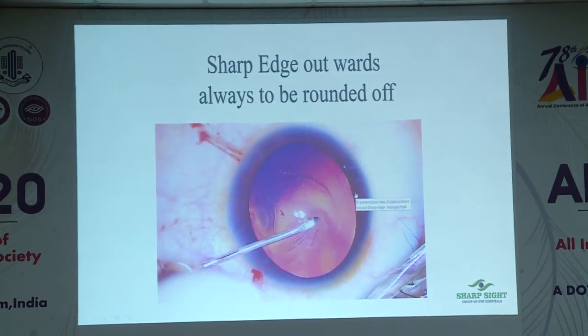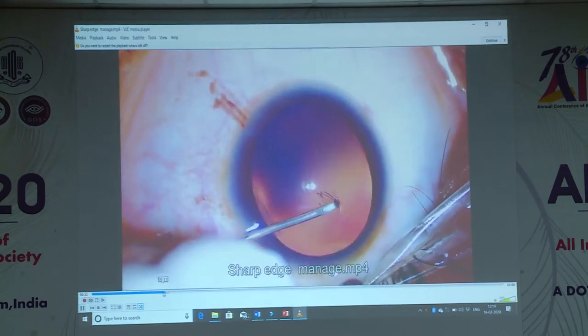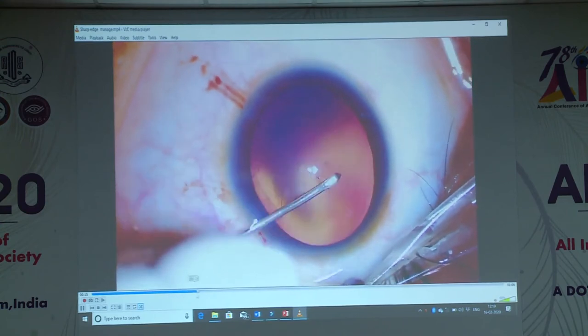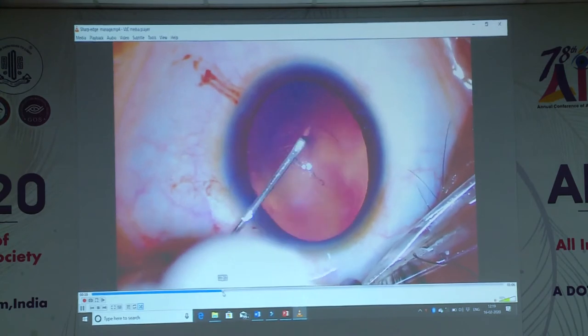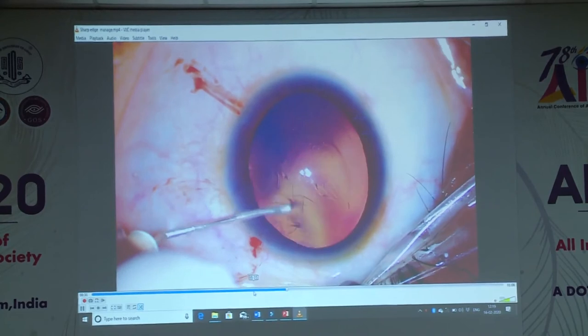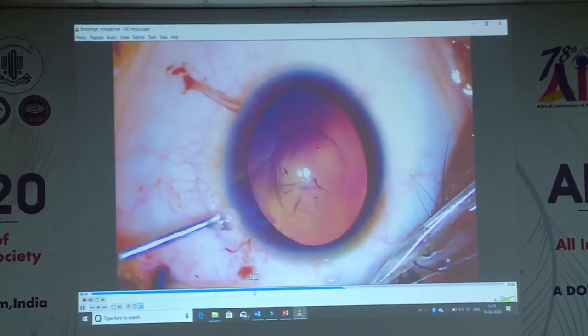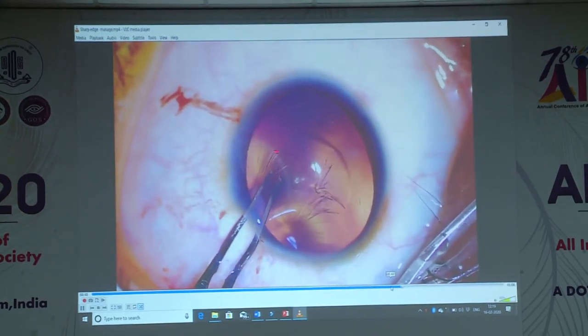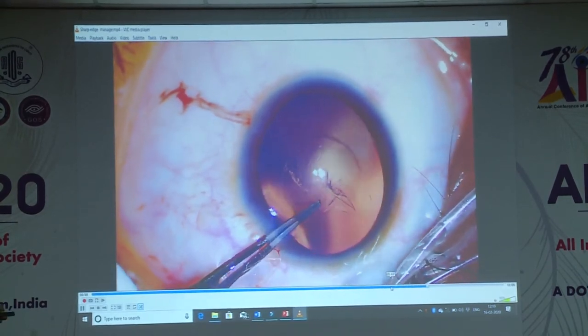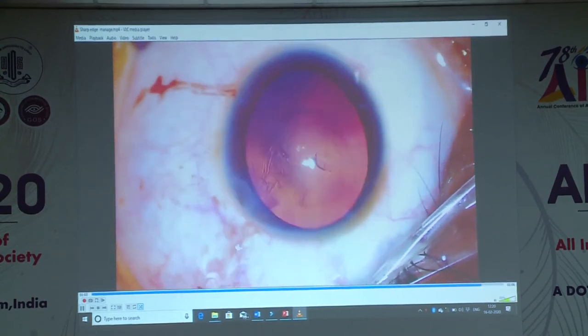If you have a sharp edge — you are doing a rhexis and you have left a sharp edge, meaning there is a V-cut shape pointing outwards — always get it rounded back again, because this sharp edge will extend into a posterior capsular tear. In this video of a clear lens extraction, the rhexis starts comfortably, then slightly goes out of control. I get it back, but I have created a sharp edge. If you leave it, especially when the rhexis is small, this edge has a tendency to rupture out. So even once you've completed your capsule rhexis, always go back and round that sharp edge again. This pointing edge outwards is a recipe for disaster — it will trouble you when you are engrossed doing your phaco.